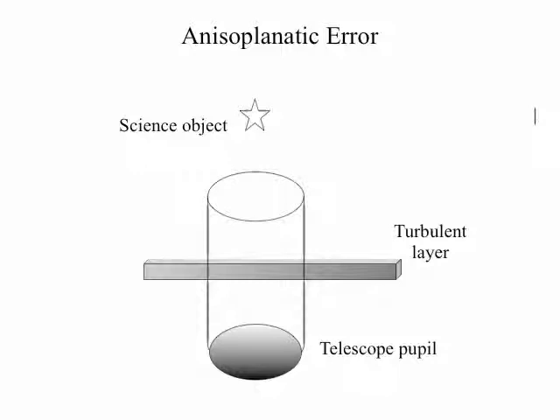Certainly, the one reason that we can't do it with spectacles is that even if you produce a spectacle lens that corrects for the wavefront, as soon as the patient glances somewhere other than primary gaze, the wavefront correction of the lens is no longer going to line up with the aberration of the patient's own eye. So this is not something that's correctable with spectacles. However, wavefront errors are not the domain exclusively of ophthalmologists, and one big area where wavefront is an issue is in telescopes.